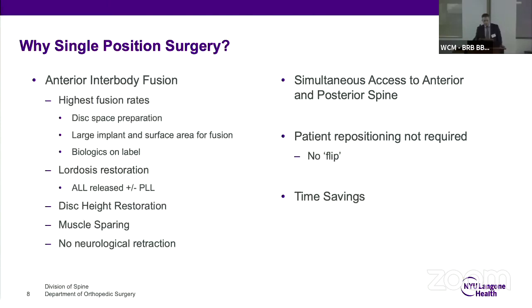We've looked at this in detail, and I think some of the advantages are that you can do more anterior interbodies, like with A-lifts in the lateral position and with laterals in the lateral position. The lordosis restoration is significant because you're doing an ALL release, you're restoring disc height and therefore foraminal height. So I think there's a lot of advantages to single position because of that. And then it transitions nicely into minimally invasive surgery, and you can do all the axes simultaneously, anterior, lateral, posterior. You can be working in two places at once, which is a huge improvement. And there's no repositioning, no flip, no reprepping, no redraping, and you close the wounds simultaneously.